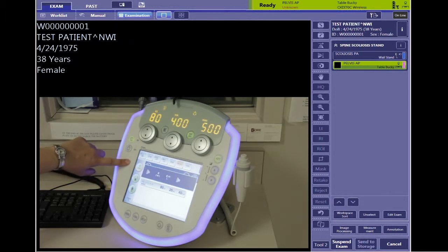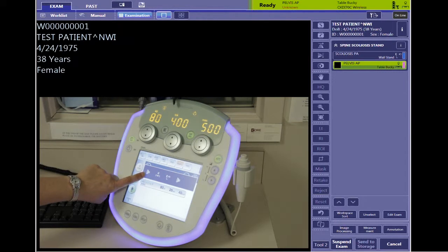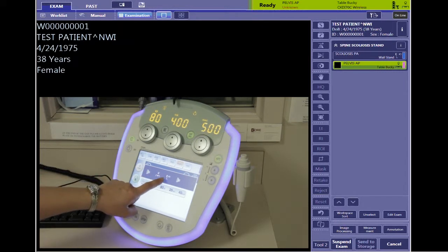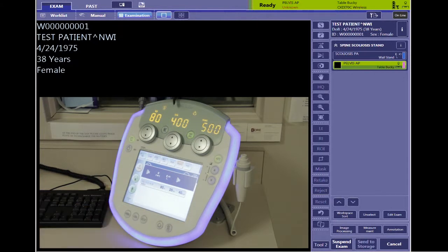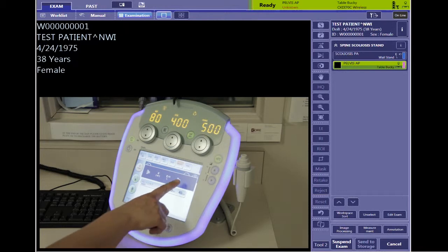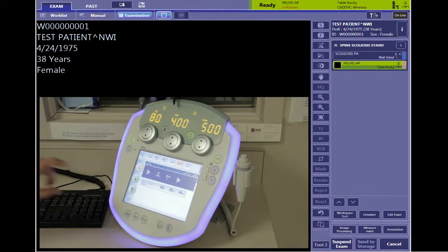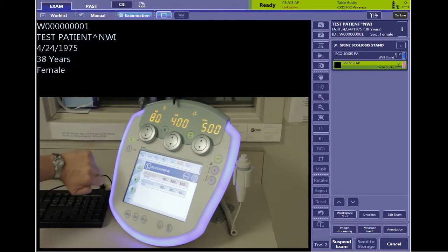On the left side you'll notice the icon for the table. There's an icon for cassette or free cassette, or tabletop — this is your table Bucky, this one is your wall Bucky, and the last one is for non-canon work. So if you're going to do a film onto the CR cassette, or you have a physicist that wants to do testing without involving the Canon system, or even tube warm-up, those will all be on that last choice.